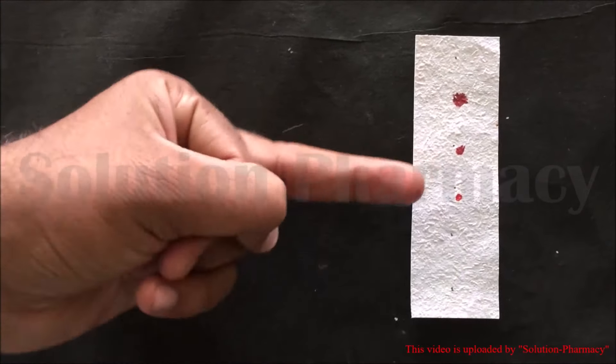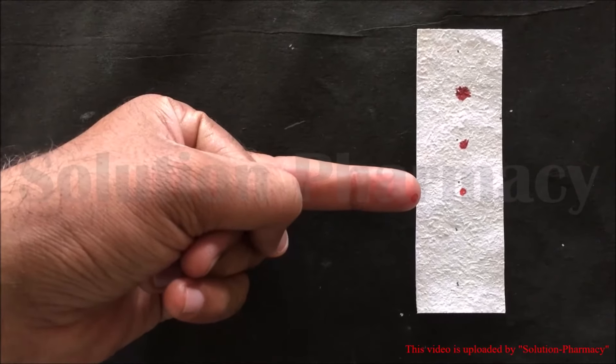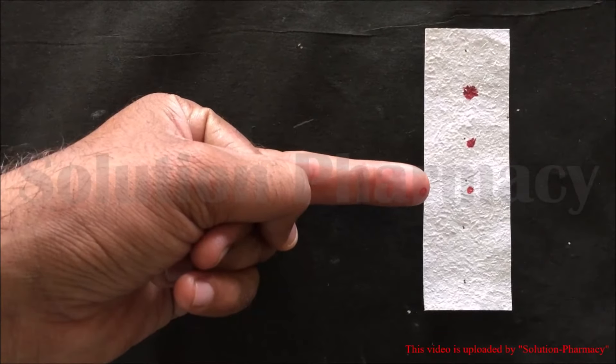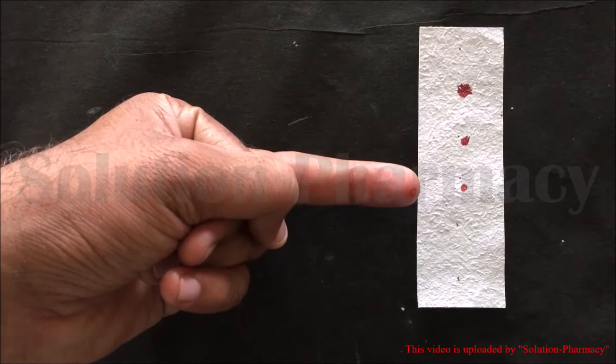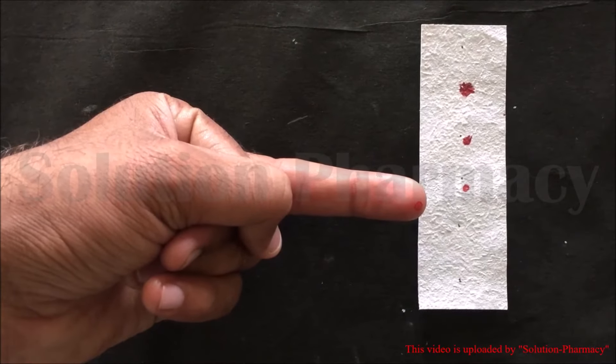After the next 30 seconds, apply the pricked side of the fingertip on the filter paper again. You can observe that blood stains the filter paper. This blood spot is lighter and smaller than the other two spots.